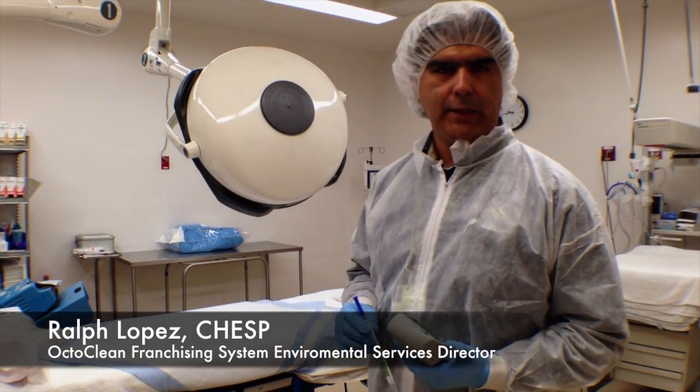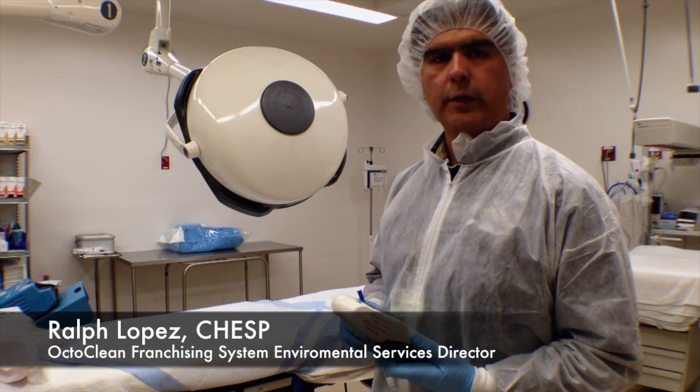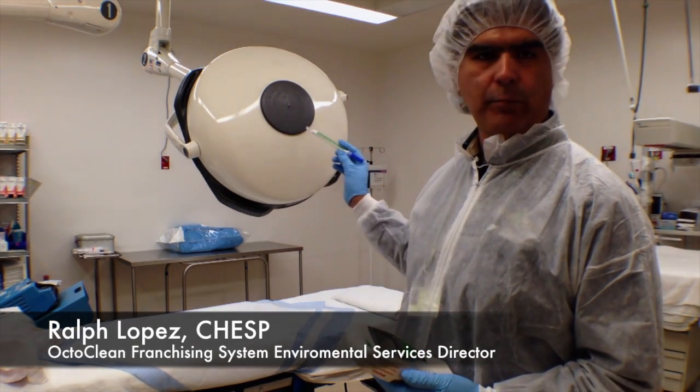Hi, my name is Ralph Lopez. I'm the environmental services director for Octoclean, and today we're doing a little demonstration of the 3M CleanTrace ATP system. What we're going to do today is measure this exam light here.